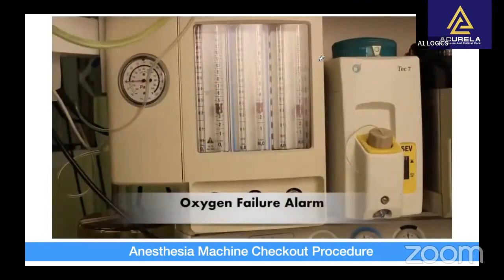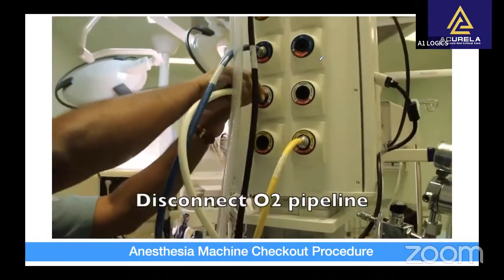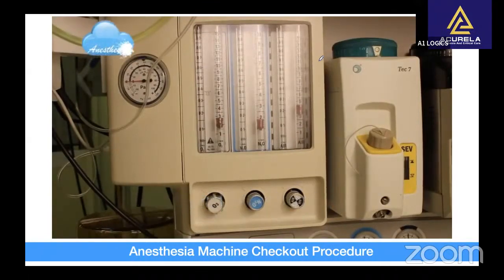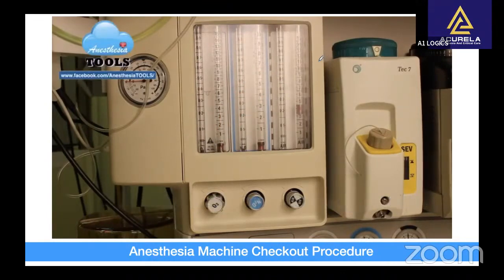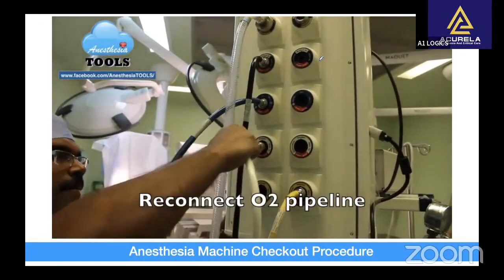To check for oxygen failure alarm, set the oxygen, nitrous oxide and air flow to mid-range. Disconnect the oxygen pipeline. See that nitrous oxide and oxygen flows reduce consistently, but oxygen flow comes down the last. Air flow continues and oxygen failure alarm should go off. Now reconnect the oxygen pipeline.